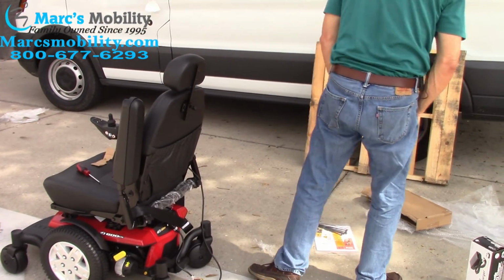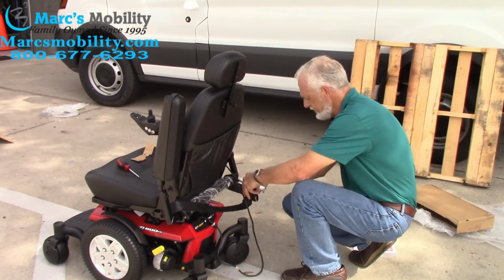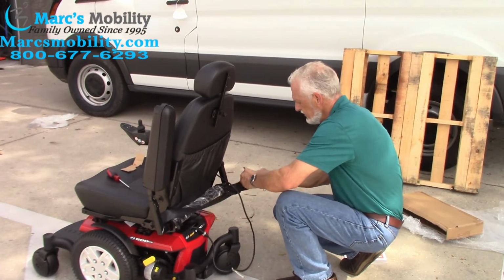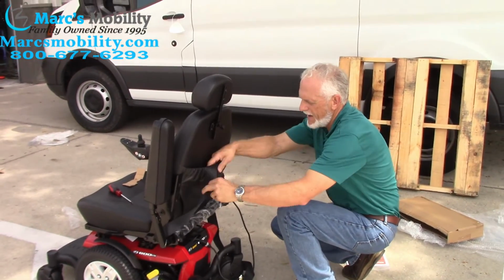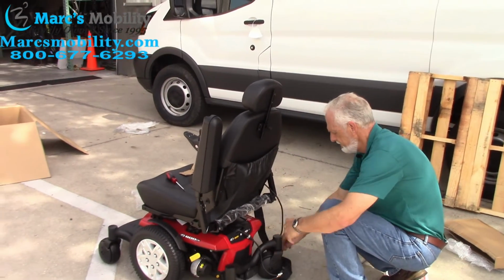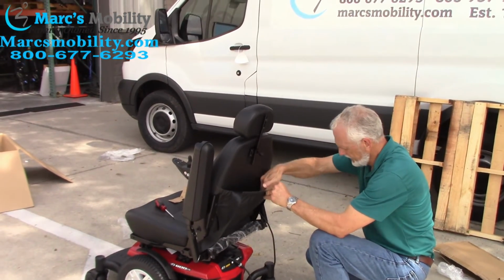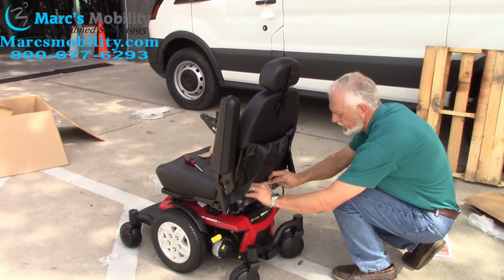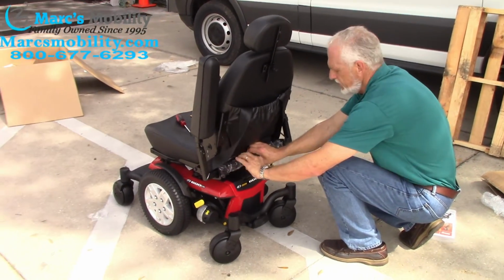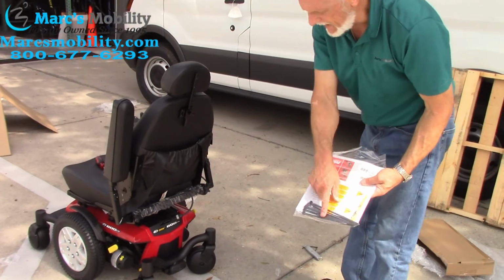Let me get rid of this. Let's put the belt. The belt is in our way here. All right, so the safety belt is here. I'm gonna put the safety belt in the back seat for now so you can see what I'm doing. There we go. You're gonna take this cable and you're gonna tie it on this seat right here, by here, with the tie downs that are included in your bag, okay?